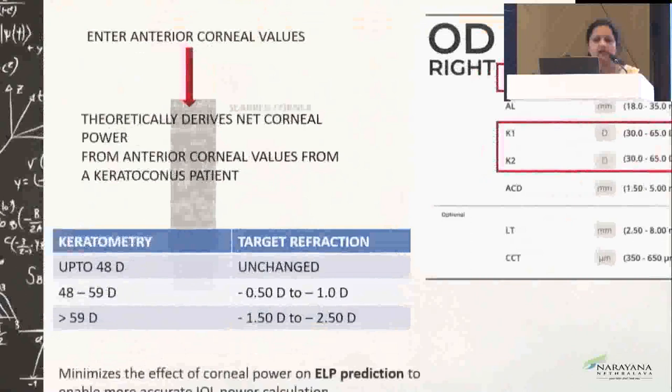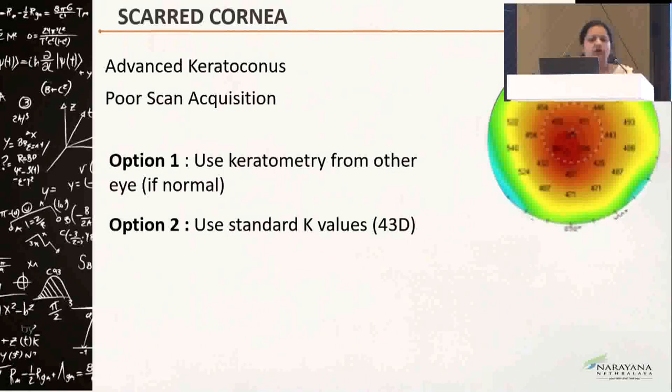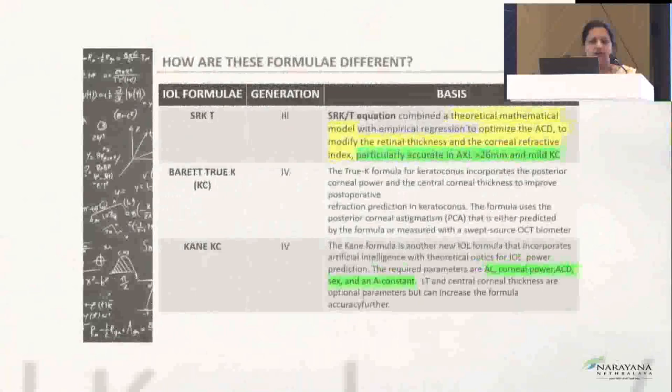In advanced keratoconus, or in cases where scan acquisition is difficult, or in scarred corneas, we can use the keratometry from the other eye or use standard K values for IOL calculation.